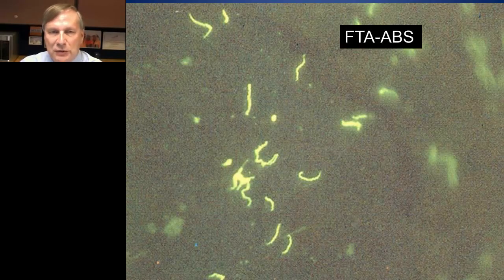The next one is our old friend again, the FTA, been around for a long time. Very good assay. We have the treponemes on a slide. We put the patient's serum on. If there's antibodies, they'll attach to the treponeme. Again, specific antibodies, measuring specific treponemal antibodies with your treponemal assays. And we put our anti-human conjugate, conjugated with fluorescein, and we'll see nice, bright, glowing treponemes in the case of individuals that have antibodies to syphilis. Nice positive FTA.